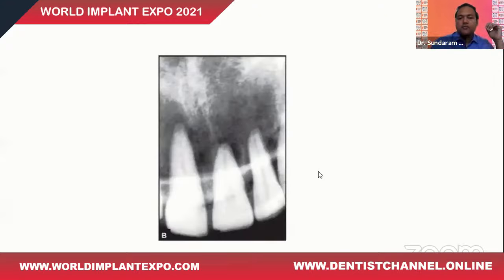Now, this is a simple radiograph of the upper anteriors. And what do we see over here? We see the upper anteriors are shortened. They are not of actual size. You can see one of them is elongated, one of them is shortened. So you don't see proper angulation in such a radiograph, which is a common scenario as far as an intraoral periapical radiograph is concerned.